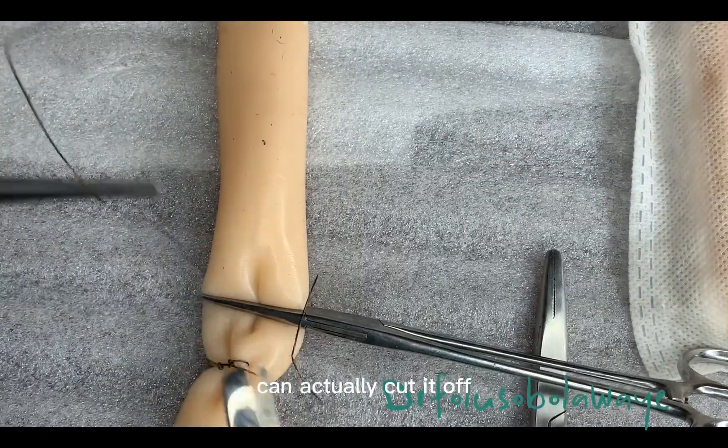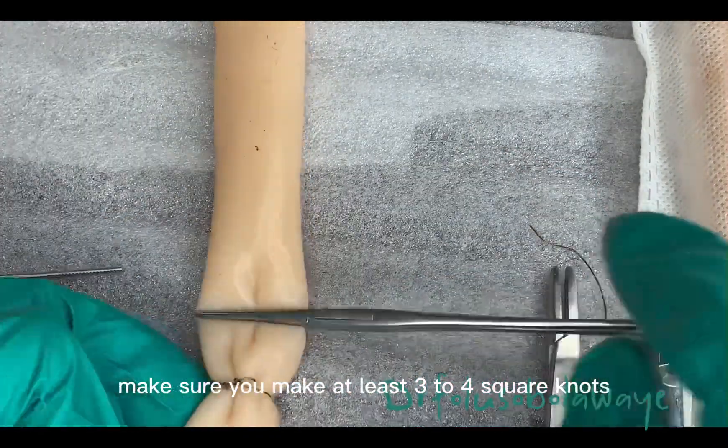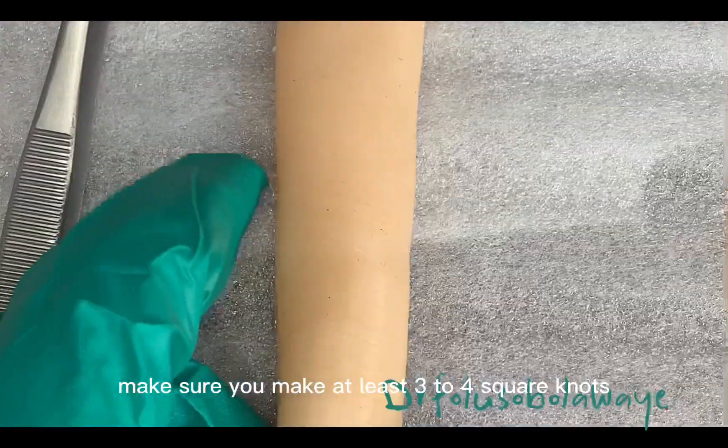So once this is done, you can actually cut it off. Make sure you make at least three to four square knots.